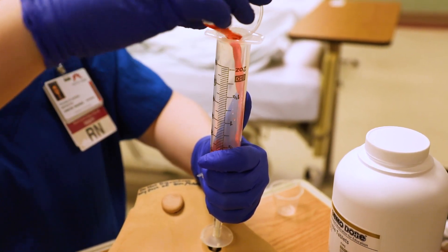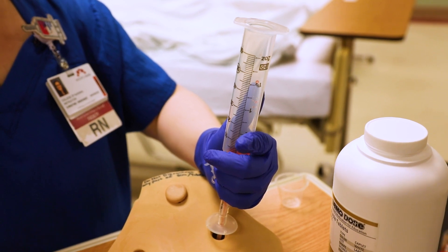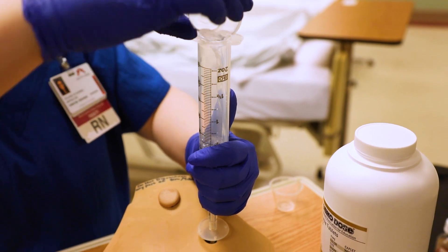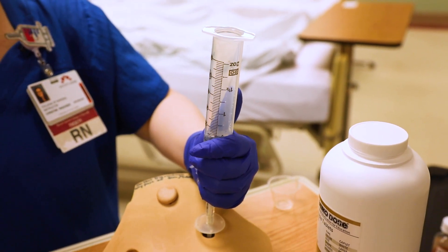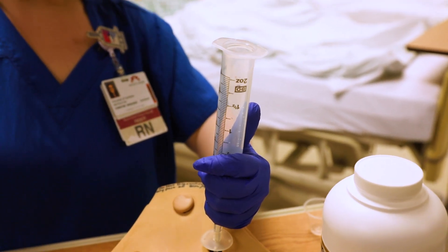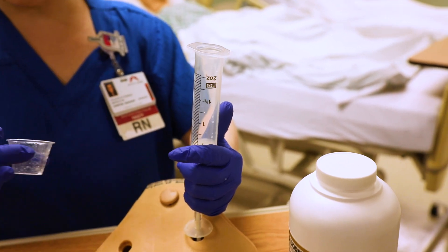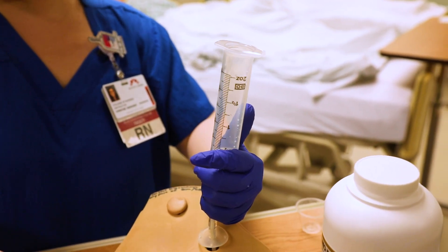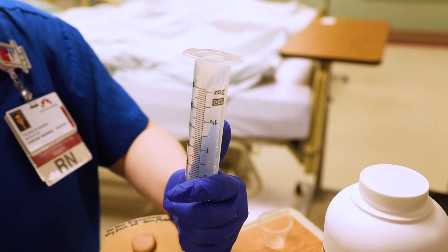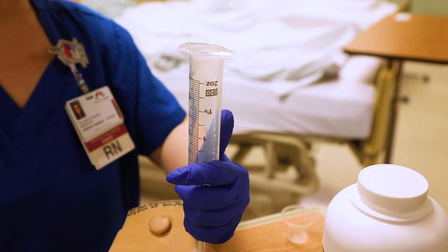Next I'm going to put in the first medicine — the liquid — and let it go down. Then I flush between medications, because there might be some of that medicine remaining in the tubing — another 20 ml's. Then we have the powder. The biggest thing is to make sure the powder is nicely dissolved before administering. I'll drop it in, and if there's a little powder left in the cup, I'll add a little more saline to help get all of that medicine out.